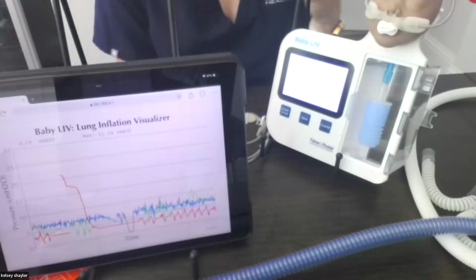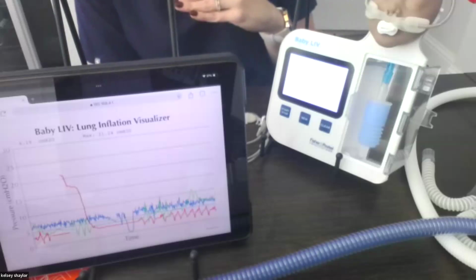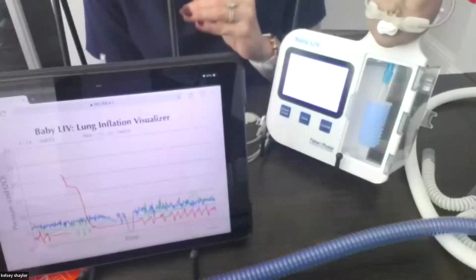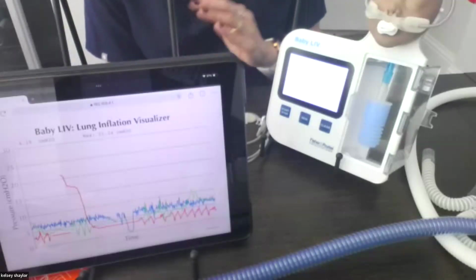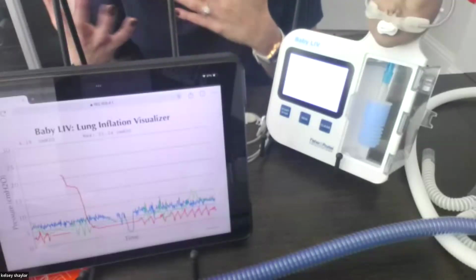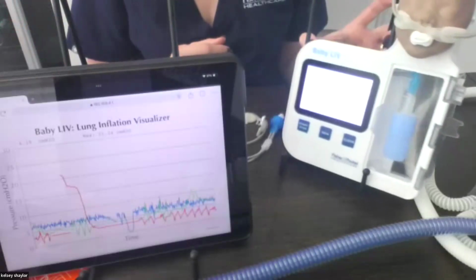And if your patient starts to decline, do we need to go up on our flow? I see a lot of the times folks going up on oxygen when they've already weaned down to those lower flows because they don't want to go back up on the flow. That can impact feeding and things like that. But a lot of times that can falsely inflate what they need in terms of oxygen, right? So think about the way those two things play a role as well.